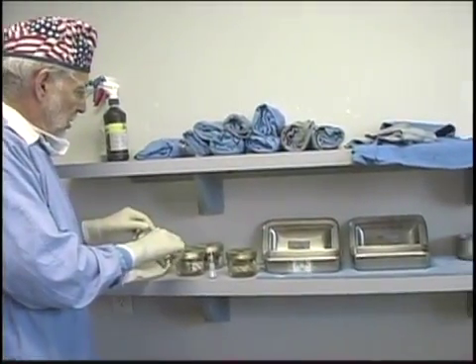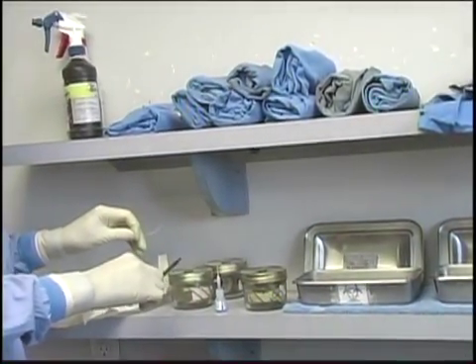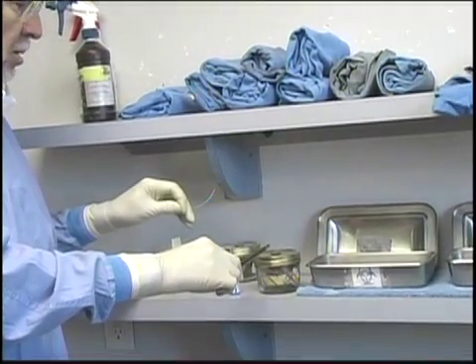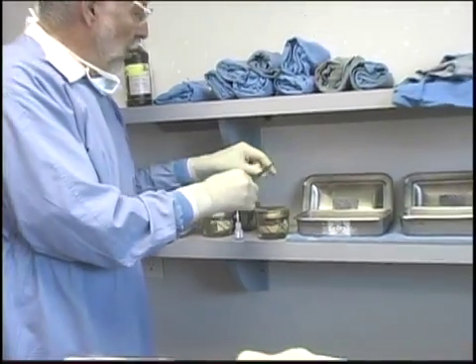We have our surgical steel in my homemade cassettes. You pull off the portion you want of either size. The large is a four-aught, or 32-gauge. The smaller material is a 34-gauge, or five-aught. I just pull out what I want, cut it, and work from there. This steel is the suture of choice for a spay-neuter clinic because of the cost — it's non-reactive, extremely predictable, and very, very strong.